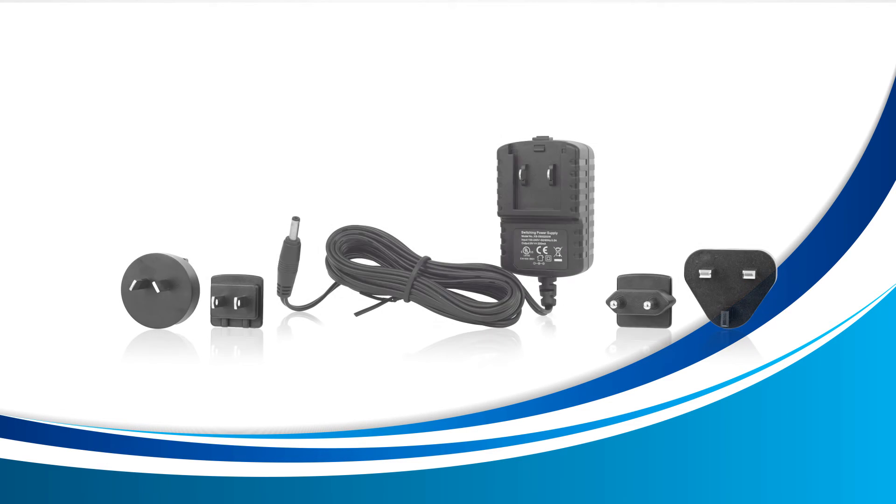The first thing you'll want to do is ensure that your device is connected to its AC adapter. Without it, transferring your data is not possible.